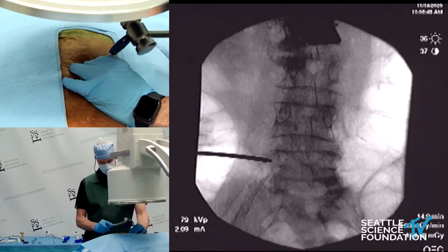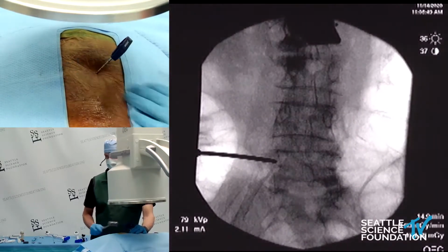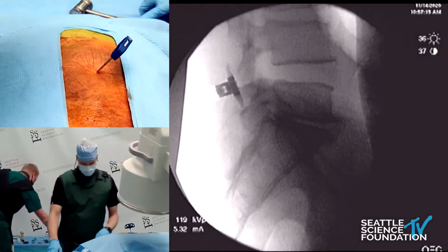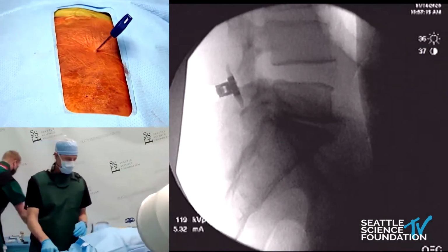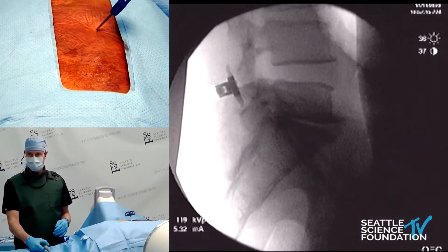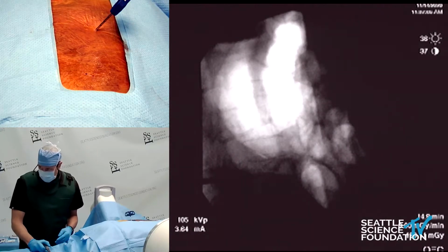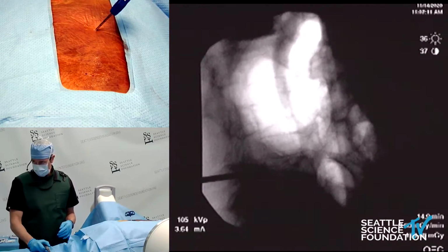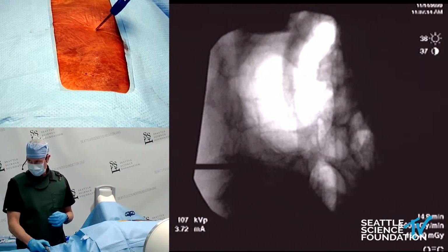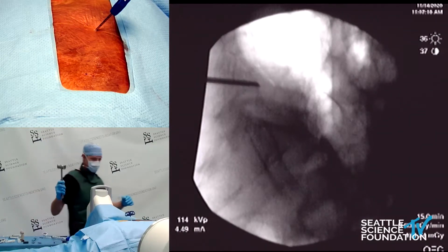And I'm going to access L5 here, so we're going to use a big balloon. All right, and let's go lateral. I'm going to try to get a 30 millimeter balloon, which is a large volume balloon that holds 8 cc's of contrast. Come down a little bit. There we go. So I really like the look of that.